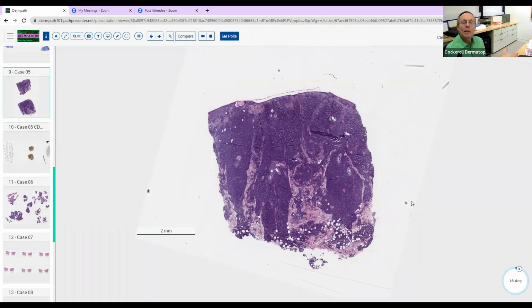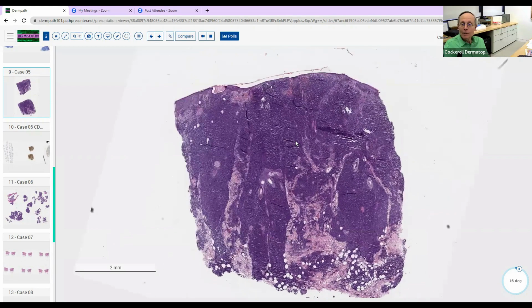So what are we dealing with, basically? I was thinking some type of lymphoma. Yes, we're dealing either with lymphoma or something in the hematologic lymphoid category. It's bad. We don't like this. Not good. So we're going to higher magnification.